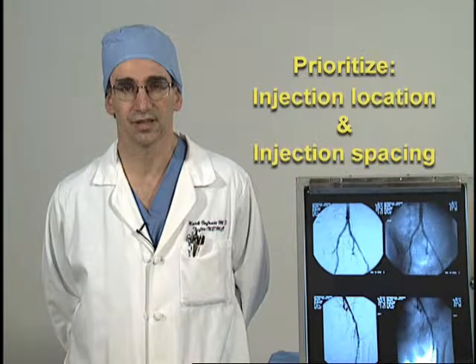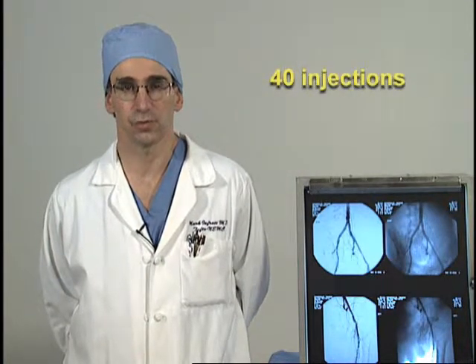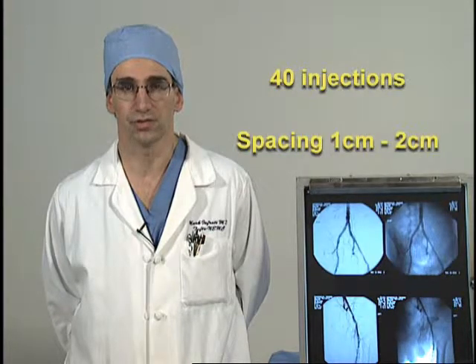The strategies outlined in the 4 cases which I will be presenting will review the ways to prioritize the injections and to space them appropriately. The study calls for exactly 40 injections in every case at a spacing of 1 to 2 centimeters between injections.